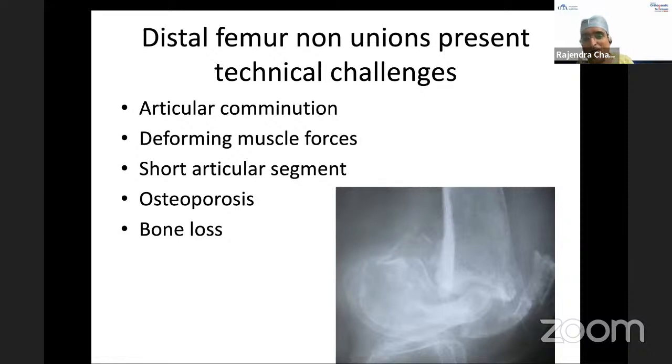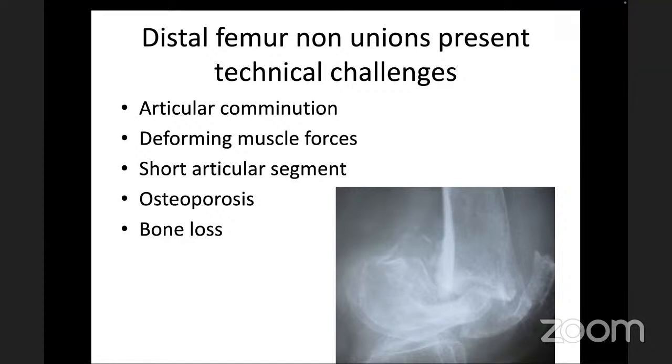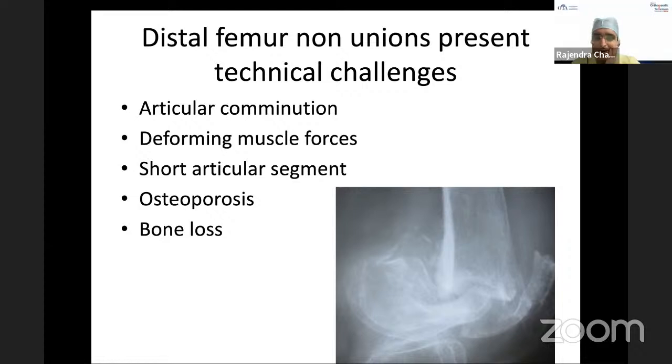And the problem was that the distal femur fragments were absolutely small, fragile. They were excavated. They had no bone. If I can take suggestions here, what would be the modality of treatment? Anyone can just suggest. Choose an arthroplasty. So the patient was senior and had knee pain earlier. Yeah, but you have chosen an arthroplasty. But in the arthroplasty, probably you will need a tumor prosthesis because you won't be able to reshape the femur. Right, put a prosthesis on that.